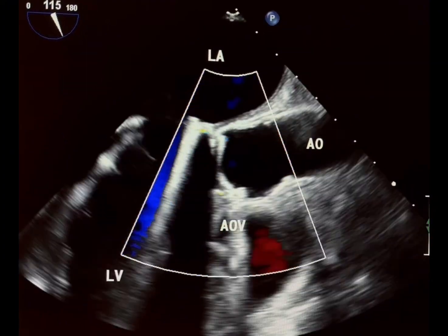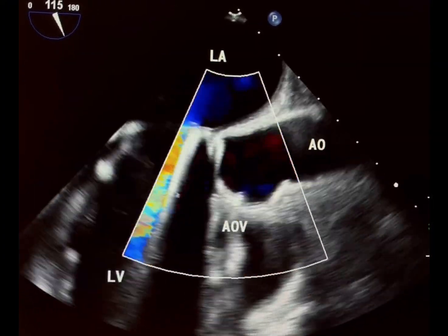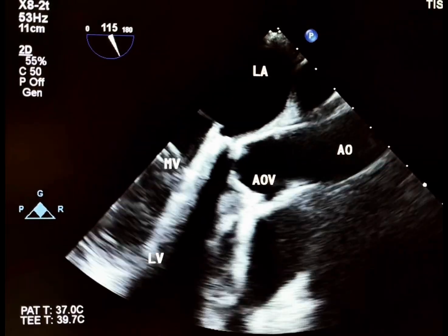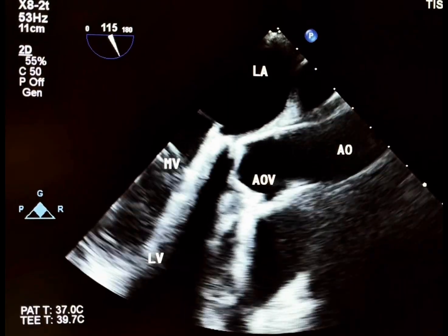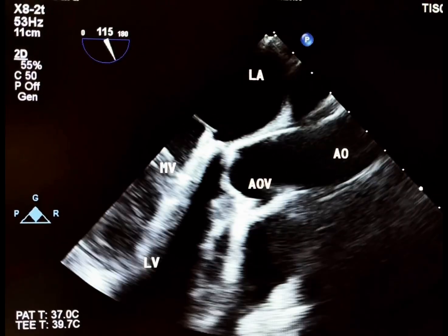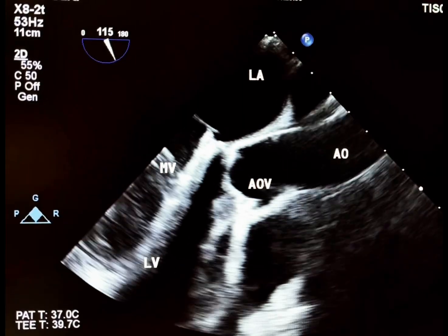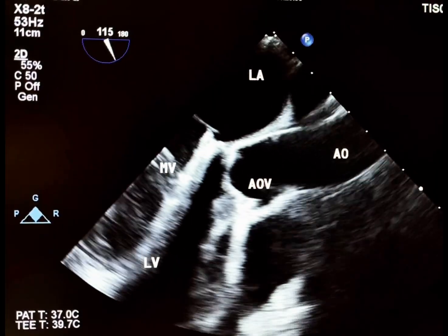Interestingly, severe PPM is generally less common after TAVI than after surgical AVR. Mean gradient depends on stroke volume, heart rate, valve size, and the patient's body size. For this reason, the pressure gradient alone should never determine the diagnosis.